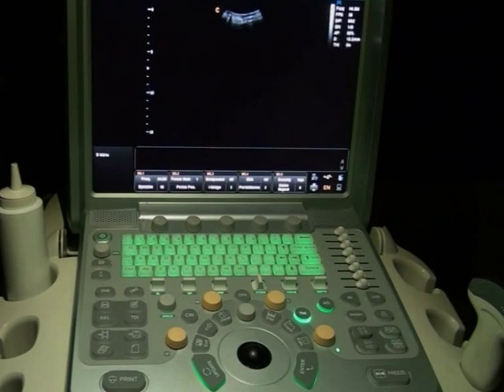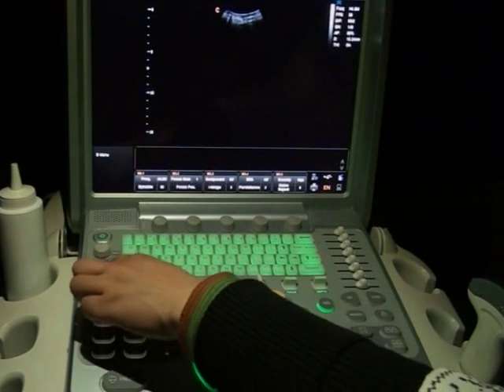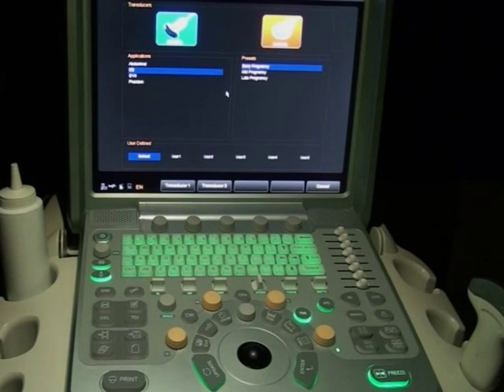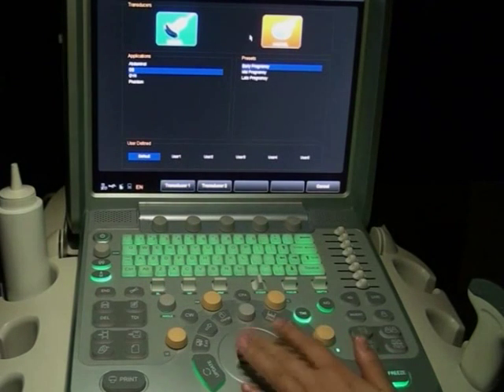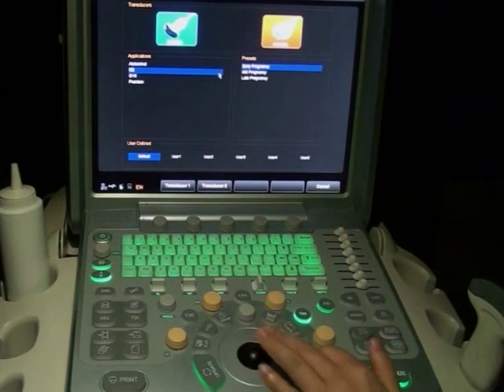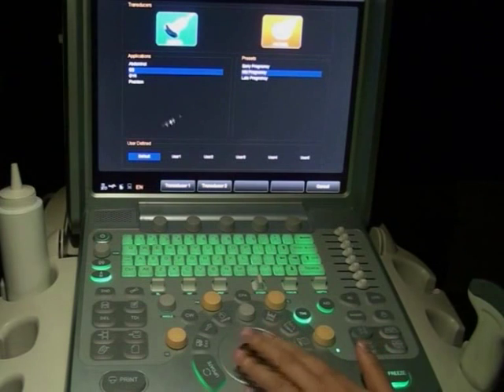In order to get a good 4D image, first of all, please make sure you have a good 2D image. Press the probe key to go to the probe selection screen. Get all the presets here. Choose the 4D probe, OB application, mid-pregnancy, and default mode.